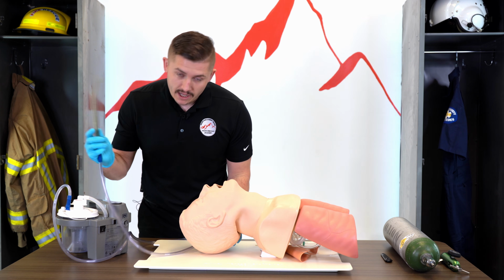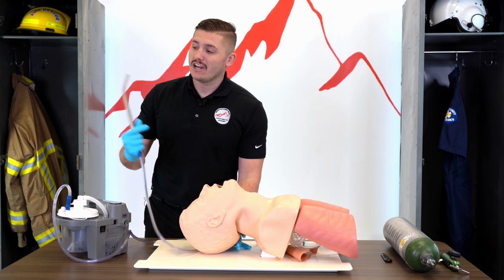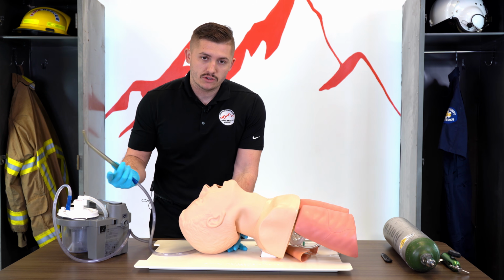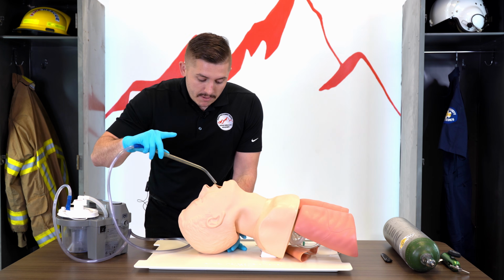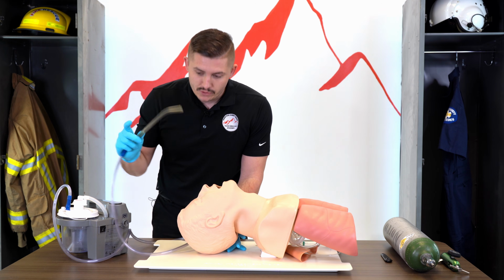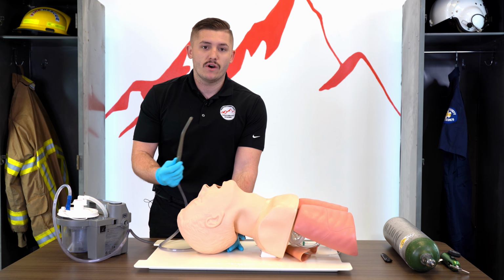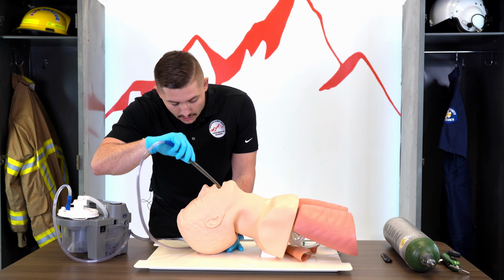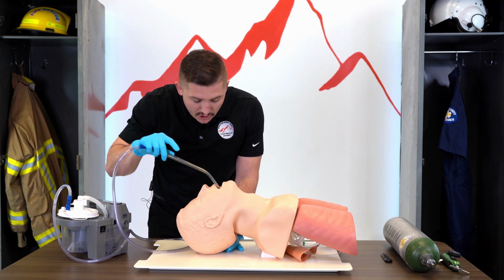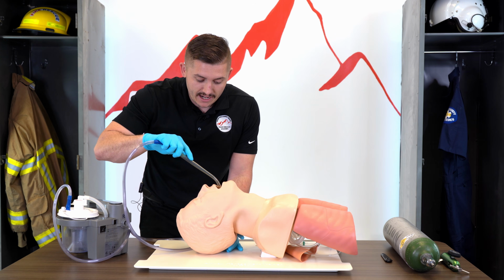So I'm going to go in. Sometimes you might need a flashlight or have a partner hold a flashlight so you can see what you're doing. If you're in the back of the ambulance, it's usually pretty well lit. But I'm going to go in without suction, and I'm only going as far as I can see. I do not want to force this somewhere where I have no idea where it's going, right? I'm not going to go into the esophagus or try to get into the trachea. I'm only going as far as I can see, and then I'm going to apply suction.